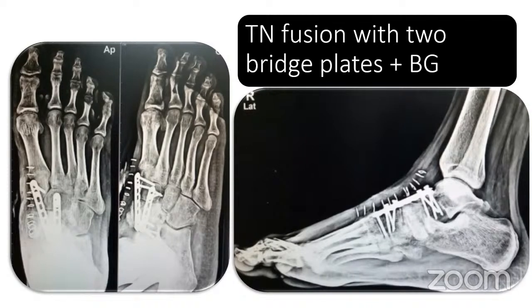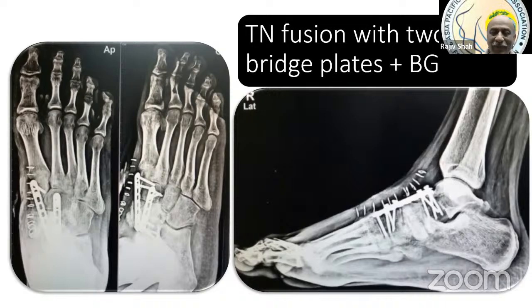And the screw heads appear to be... Do those screw heads cause any kind of irritation? Because these plates you need to remove at the end of 9 months. Okay, sir.